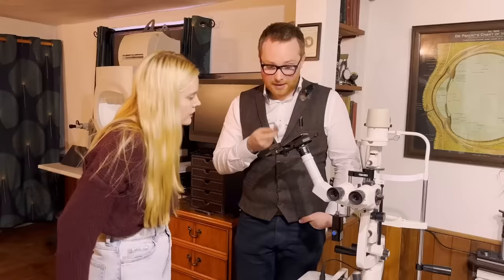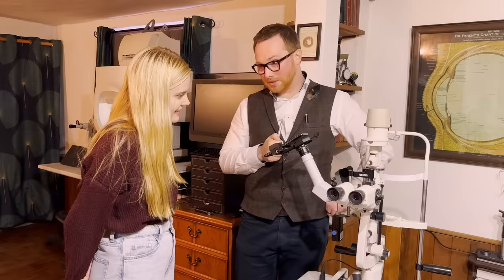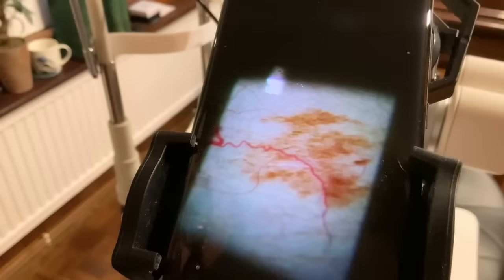Mm. And the advantage of having a camera attached to the microscope, you can just take a picture of what we see. Yeah. And you can have a look, but yeah, certainly wouldn't worry about it. It's just an incidental finding. So at least you can see what it is. Yeah, it's just there's extra pigment on the white of your eye there. So it really is like a freckle.